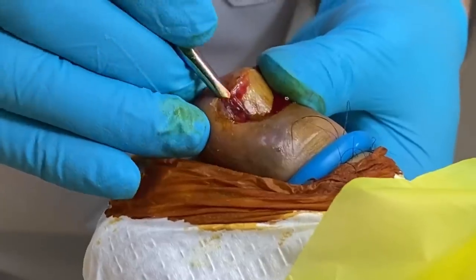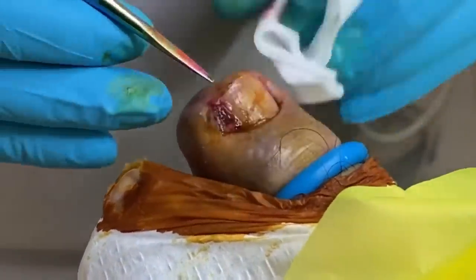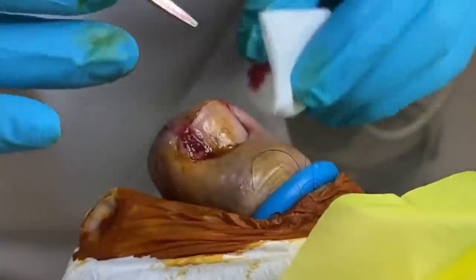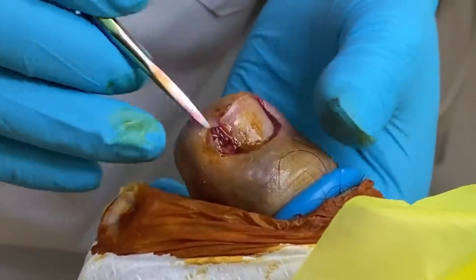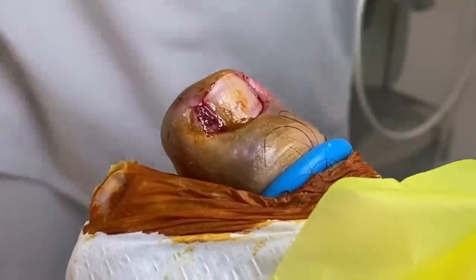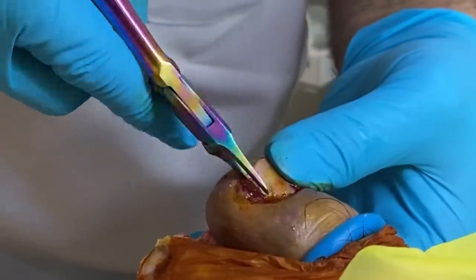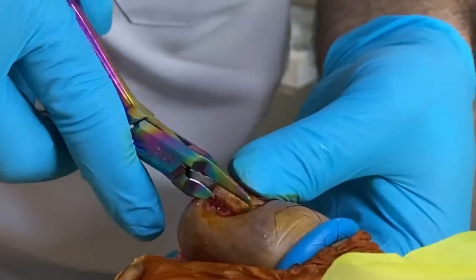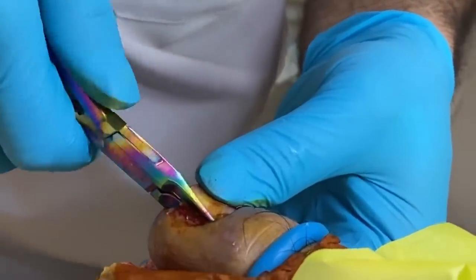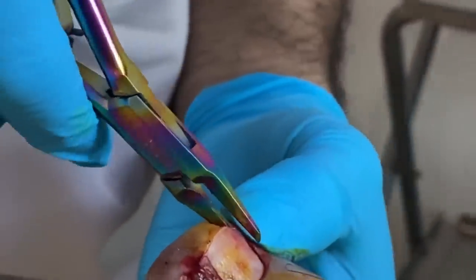When he gets to this stage and you've got a very badly infected ingrowing toenail, it becomes very difficult. He's got the tourniquet on and he's still bleeding a little bit, so this goes to show. The most important thing is we need to take this down and I'm going to have to be a bit more aggressive than I normally would, taking it down as far as we can go — about there. This side we can be a little more conservative.